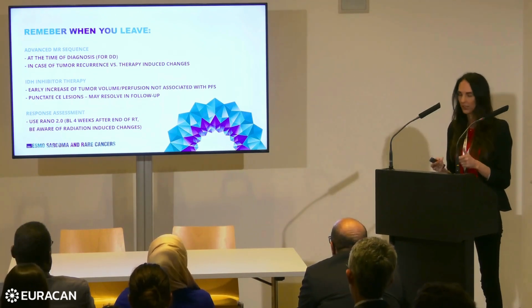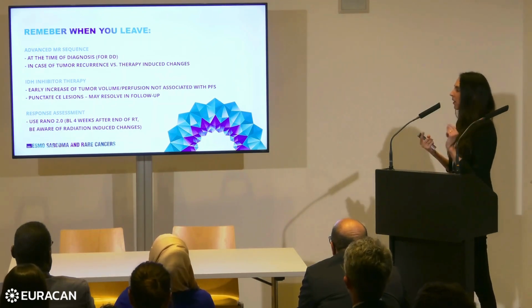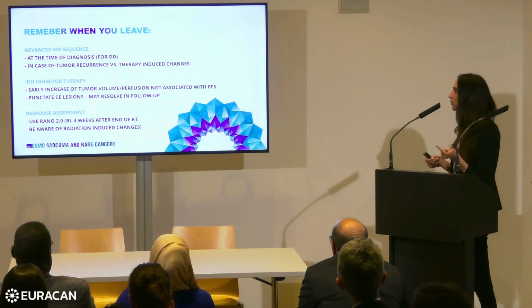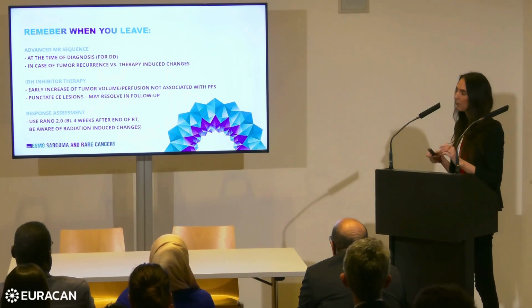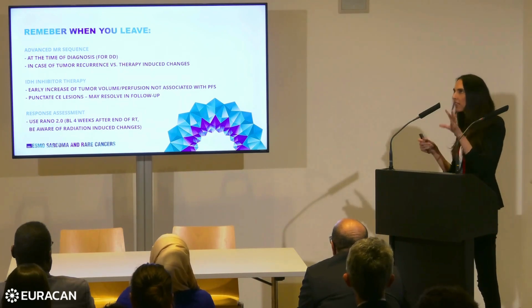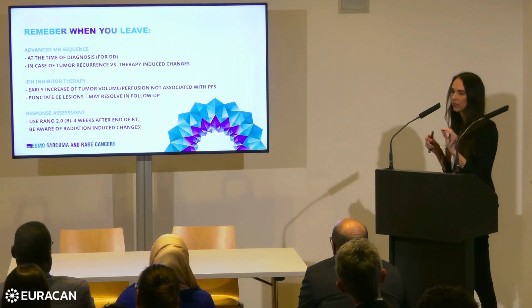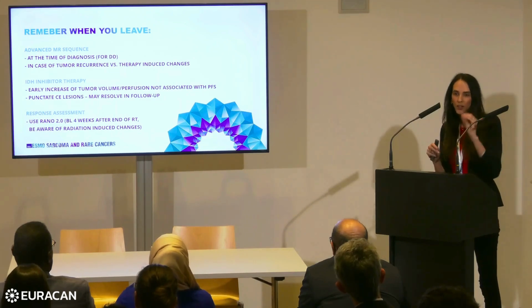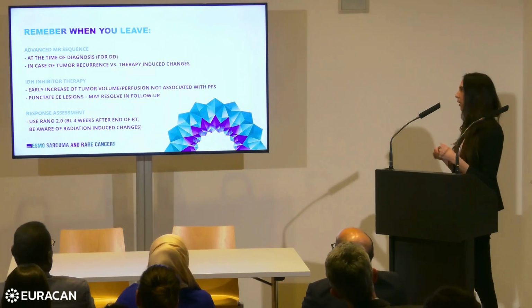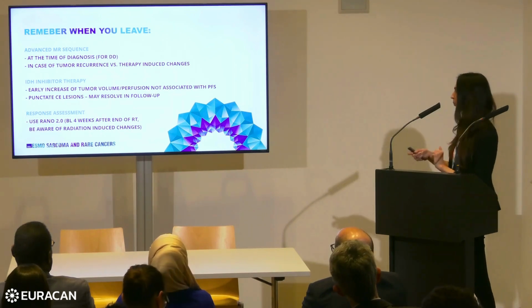When it comes to IDH inhibitor therapy, remember that an early increase of tumor volume and perfusion may not necessarily be associated with progression-free survival. And if around 16 months after the start of therapy, you find some small punctate contrast-enhancing lesion, do another MRI examination, because they may resolve or stabilize and are not always associated with tumor progression.